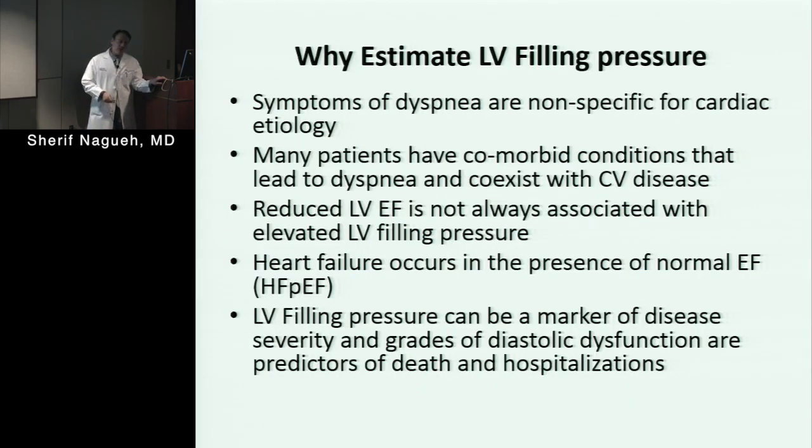So the first question is, why bother and estimate LV filling pressure? So one reason is to know if the symptoms of dyspnea that a patient has are cardiac or non-cardiac in origin. Many times patients can say they have shortness of breath, and when you critically look at what is going on, you cannot come up to a diagnosis.